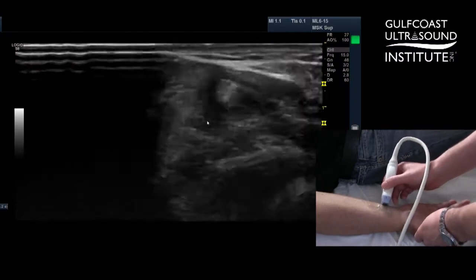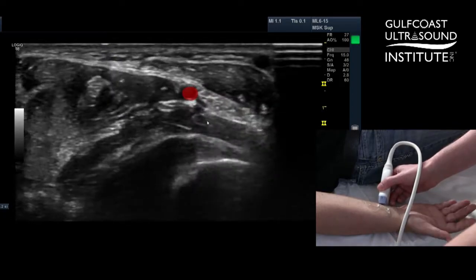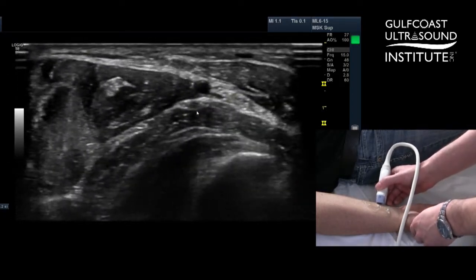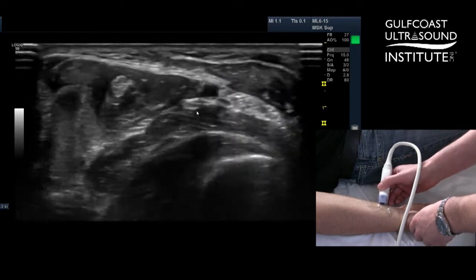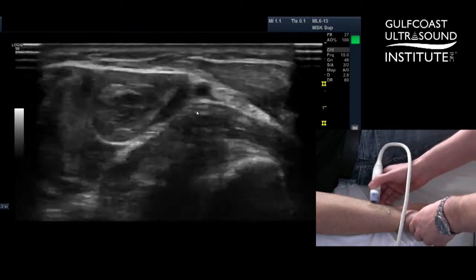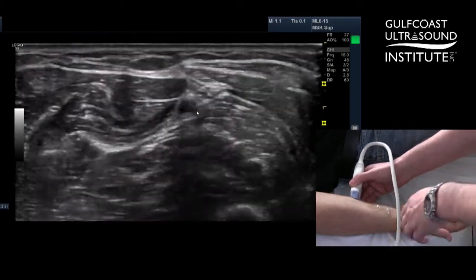To scan the peripheral nerves of the forearm, a nice easy way to start out is to find your ulnar artery, which you can see — it's in the middle of the screen here. Once you find the ulnar artery, the nerve lives right alongside it. Down distal in the wrist, they're really adjacent right next to each other. As you scan more proximal in the patient's arm, you'll start to see the nerves separate out from the artery.